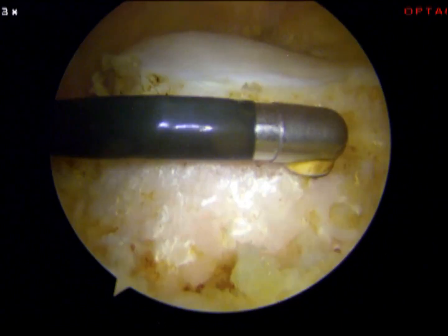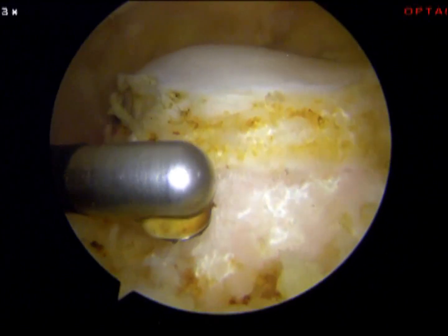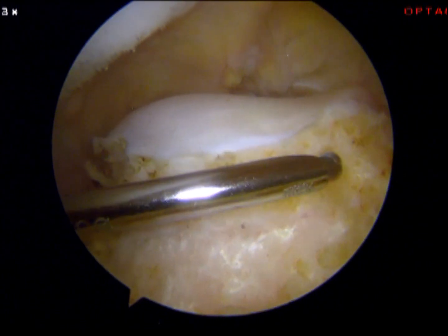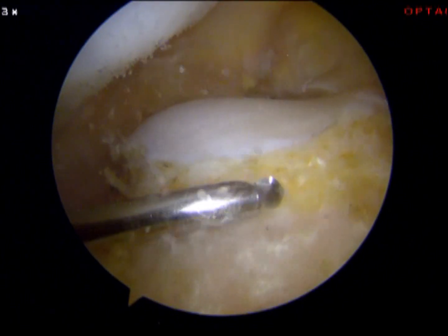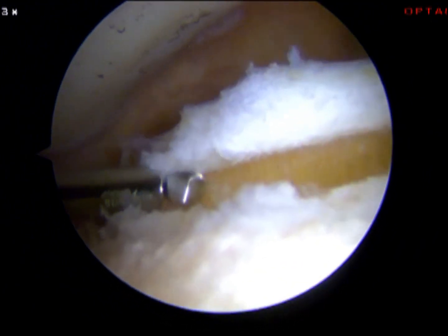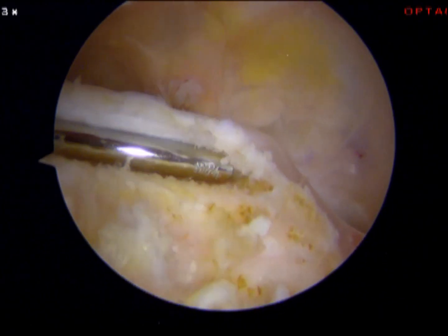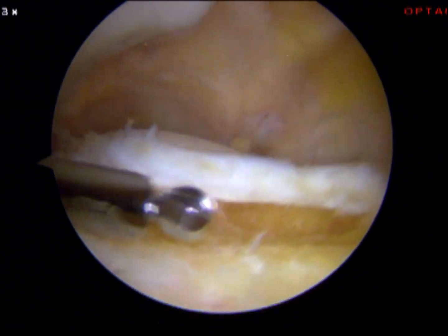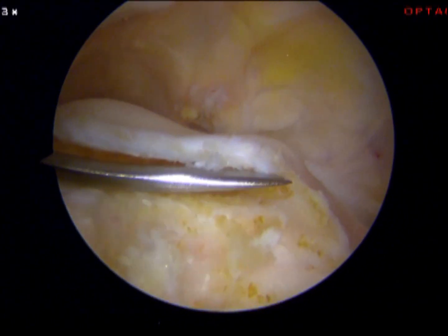This needs to be done in order to be able to go in with the shaver burr. Here you see the huge trochlear bump. And having taken away the synovia, I'm able to go in with the shaver burr. This goes into the cleavage between the bone and the cartilage. I need to remove the trochlear bump and make this cartilage flake. I just go further and further down into the knee, until I reach the area where the knee bends — then I cannot go further down.